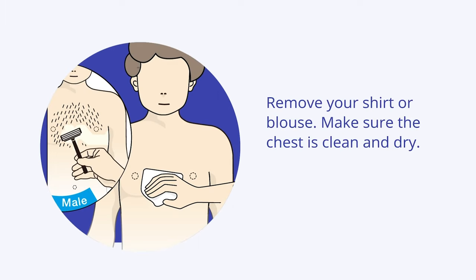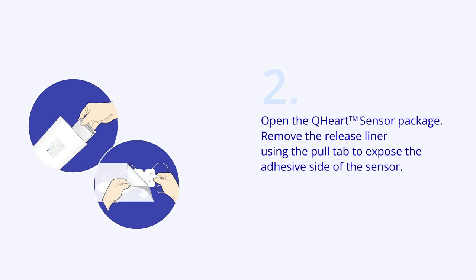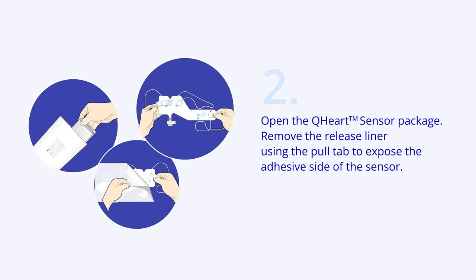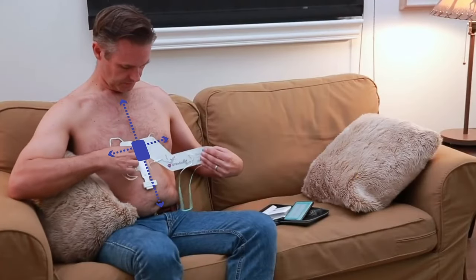First, remove your shirt or blouse. Make sure the chest is clean and dry. Open the Q-Heart sensor package. Remove the release liner using the pull tab to expose the adhesive side of the sensor. Position the blue box at the center of the chest between the nipples.